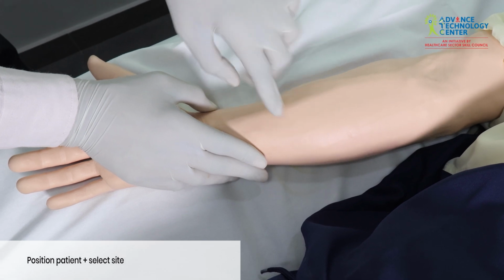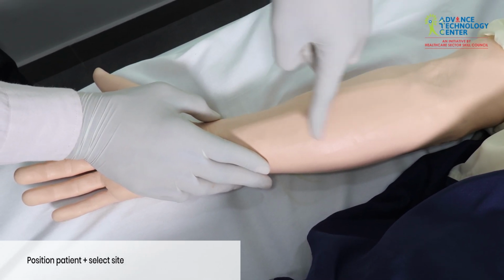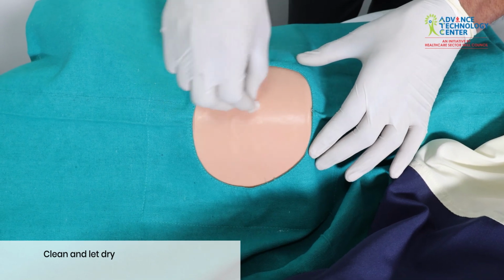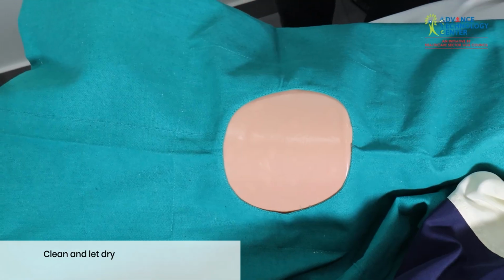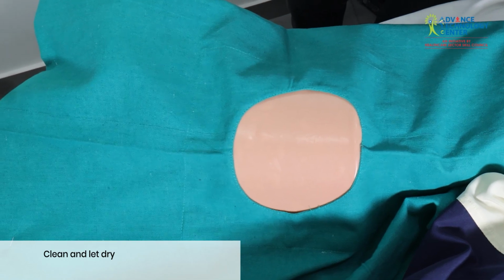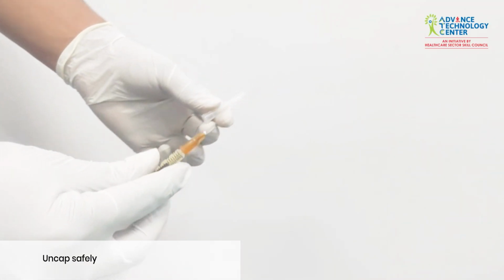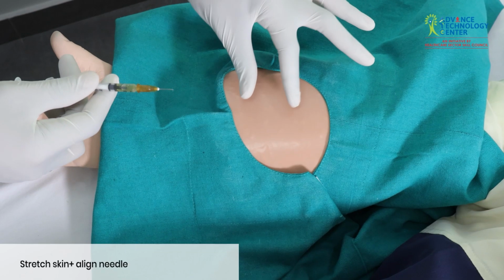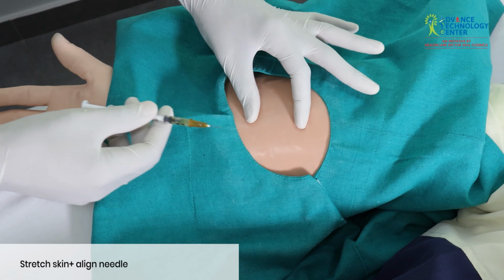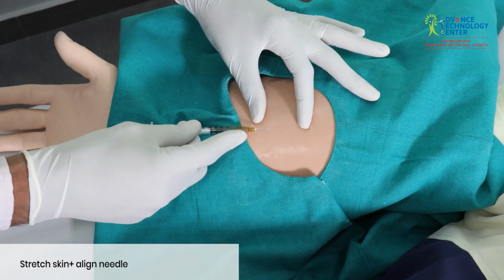Then choose a suitable intradermal injection site that is clean and easy to observe. Clean the skin using an alcohol swab in a circular motion from the center outward and allow the area to dry completely before injecting. Remove the needle cap carefully using the non-dominant hand and ensure the needle does not touch anything to maintain sterility. Stretch the skin taut with the non-dominant hand and hold the syringe so the needle stays almost parallel to the skin surface.